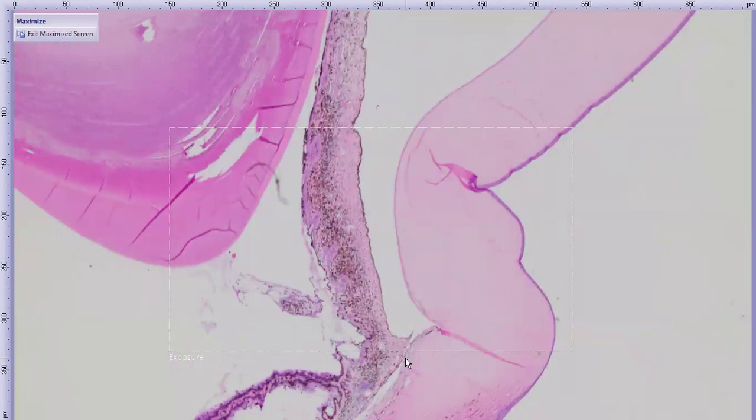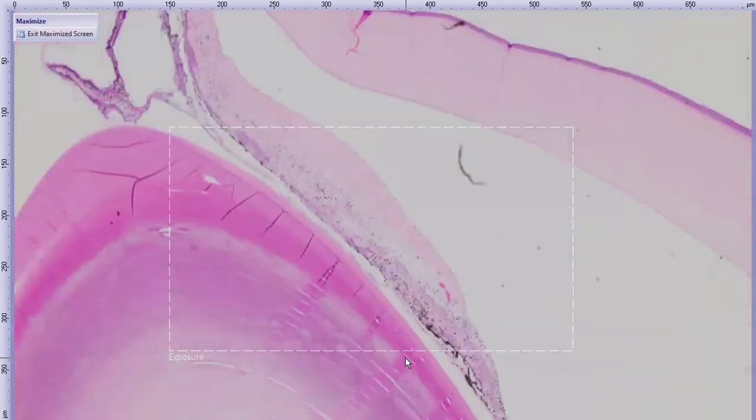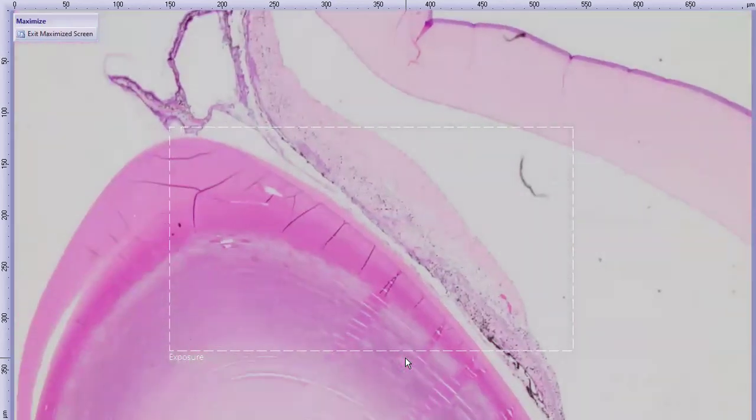And then the other reason is that this patient was on immunosuppressive doses of steroids. So steroid use may change the numbers and types of inflammatory cells that we see in our histologic sections. That's worth keeping in mind. Keep in mind that the therapies that the patient is on may change things for you. This patient also has more stuff, but I've already gone on long enough, so I'll briefly touch on this.